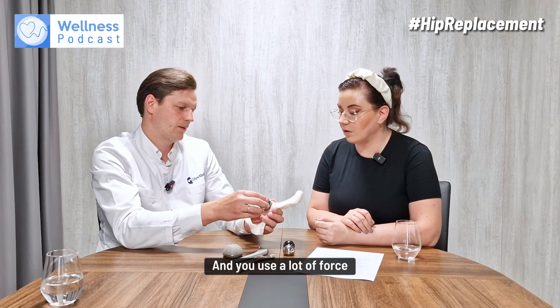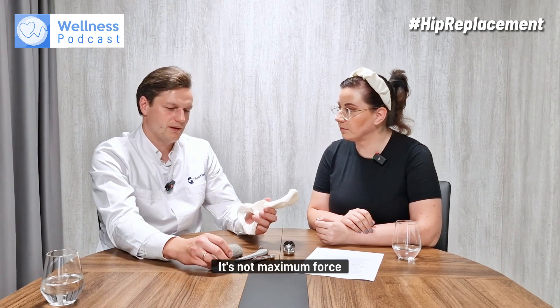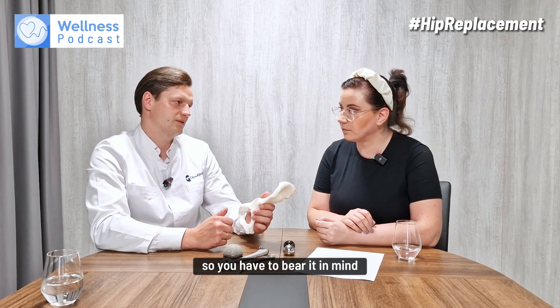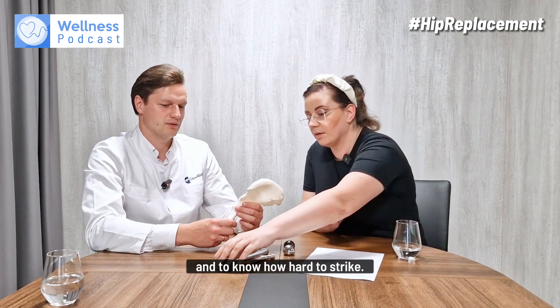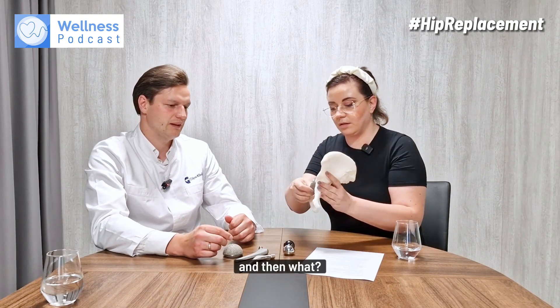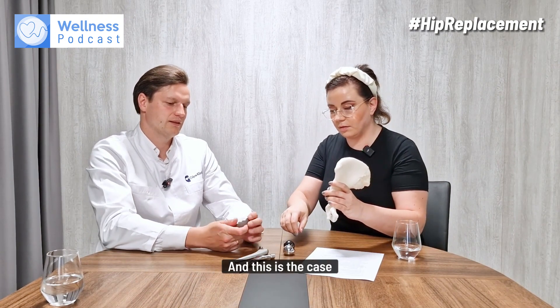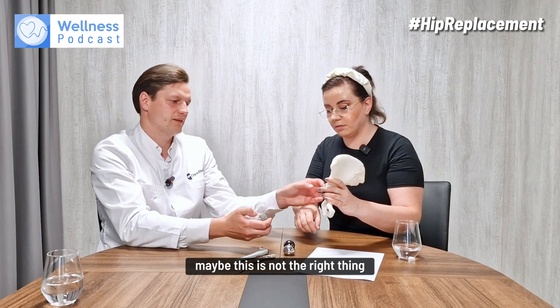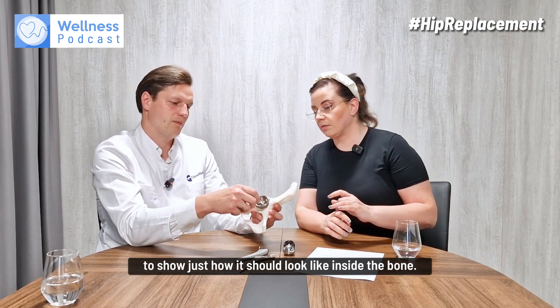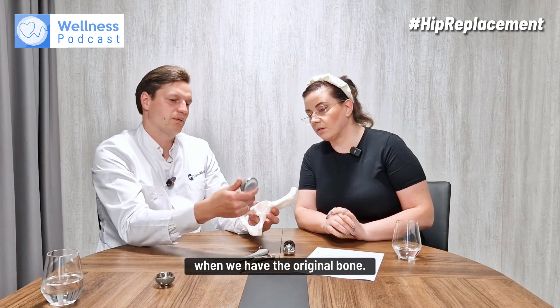A lot of force is used — I've seen that. It's not maximum force; it has to be controlled, otherwise you can cause fractures. You have to bear that in mind and know how hard to strike. So this component goes in here, and this is the case — maybe this isn't the ideal thing to show — but just to illustrate how it should look inside the bone.